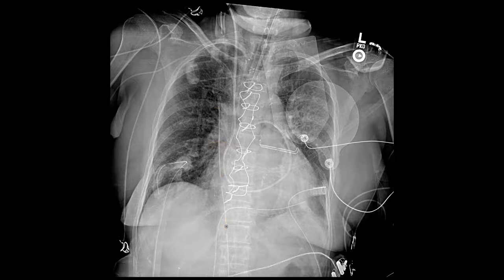What are these two lines here? Those are mediastinal tubes. This patient had their heart operated on — the chest was cracked — and before the surgeon closes up, they put these tubes in to drain any blood or fluid draining into the mediastinum after surgery. They're called mediastinal tubes and they sit right next to the heart.